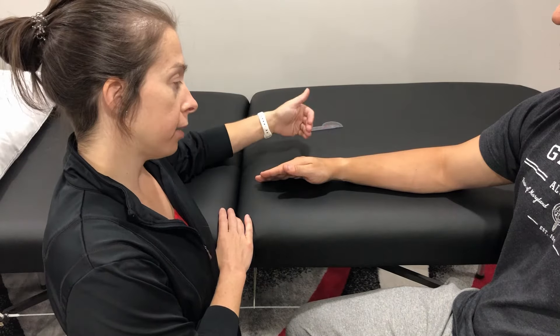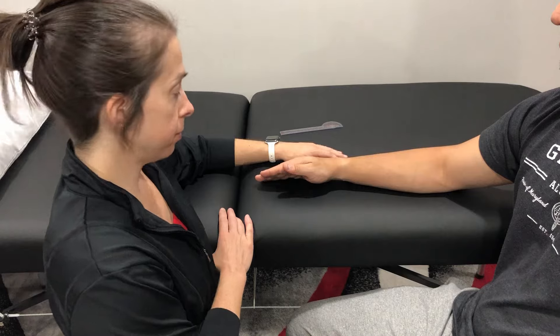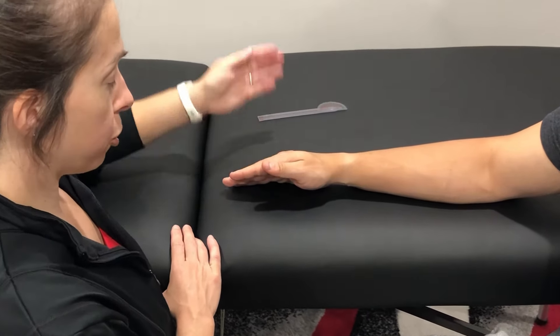The patient is seated with the forearm and hand resting on the table, ideally in a neutral position to allow measurement. Checking passive range of motion.